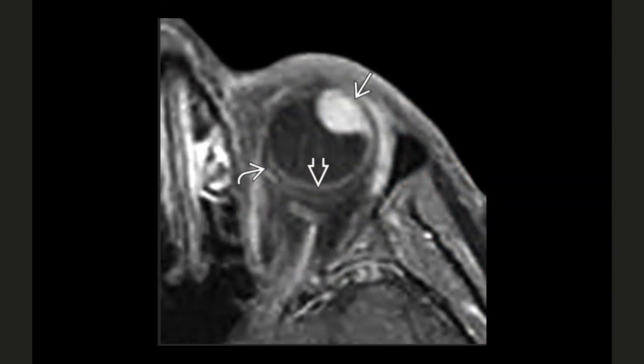And how do you tell? It's choroid. So this is a globe, right? The lens is not going to be sticking to the globe. Remember, the lens is floating. So do not misunderstand this for an enlarged lens or something. And besides, an enlarged lens is not really a pathology too. So this is in the wall. That much we can tell, right? Is it a hemorrhage or is it an enhancement? We have to figure out.